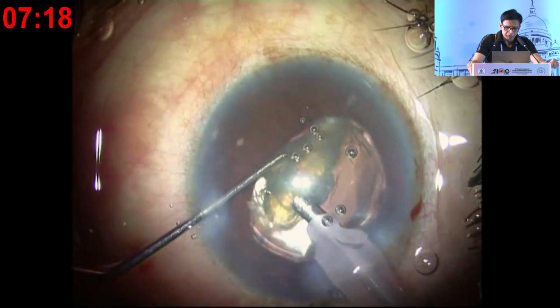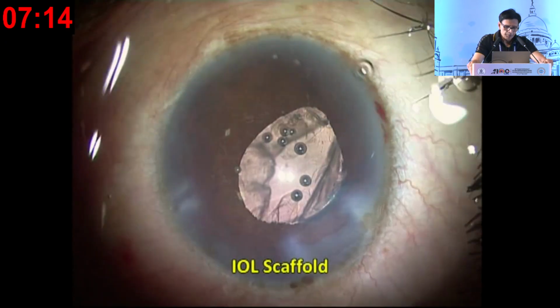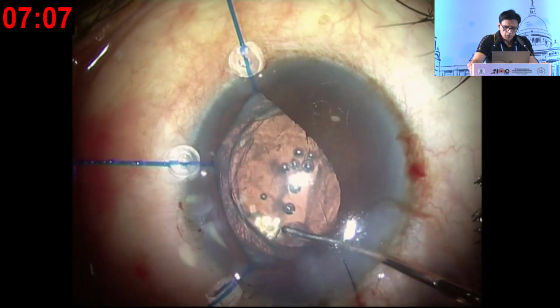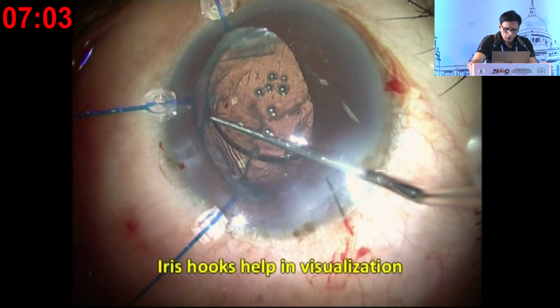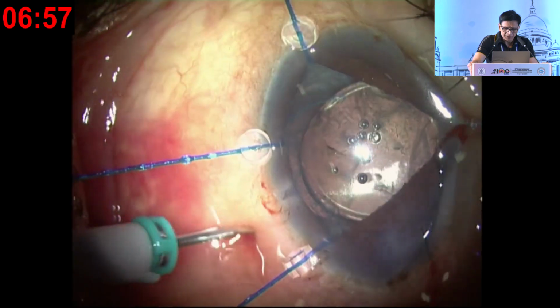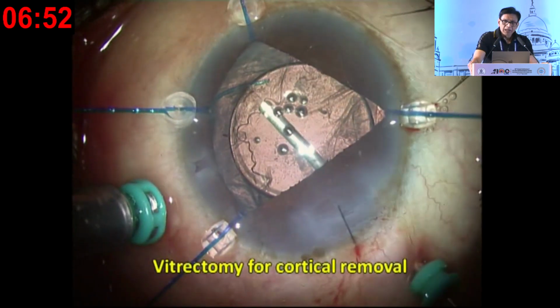Now you can go in with your phaco probe and emulsify this fragment very easily, and you can see me removing it. Now at this stage, I dilate the pupil, the iris with iris hooks, and I'm now trying to dial that lens properly and comfortably. Next step, once I have dilated it, I'll have to go in and clear it with vitrectomy probe.